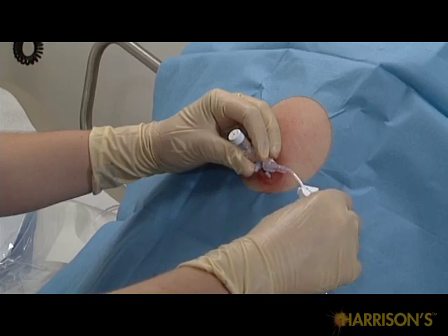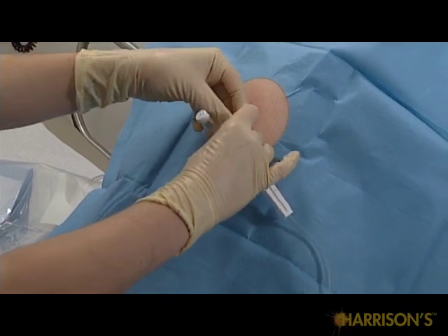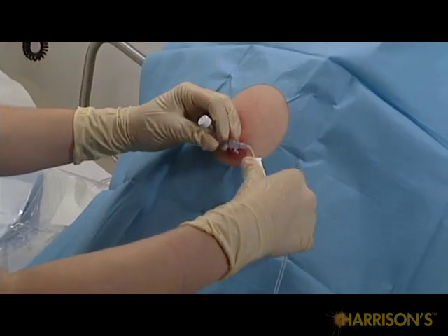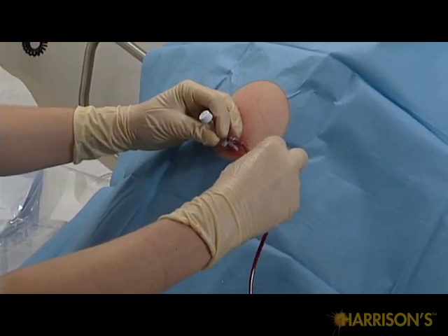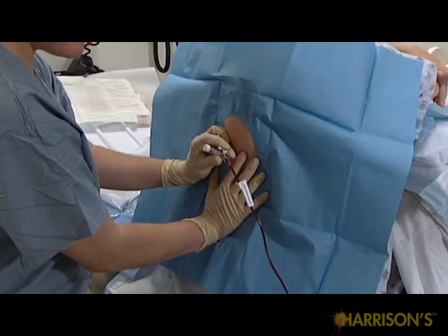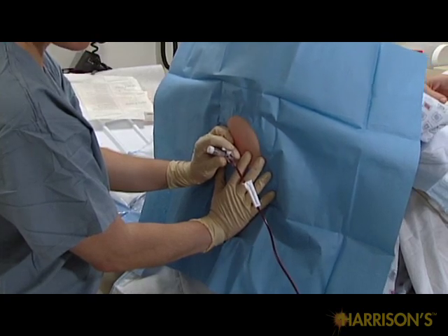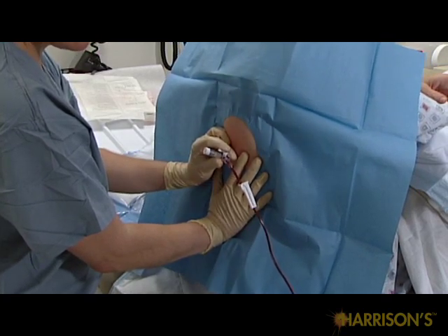Open flow with the 3-way stopcock and the roller. Keep your finger on the roller in the event you need to stop flow abruptly. Allow the patient to drain. To maximize drainage, have the patient lean back posteriorly against your hand.